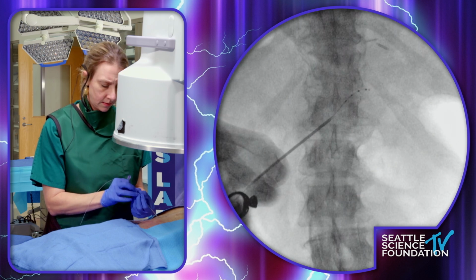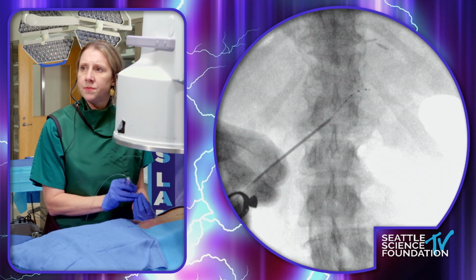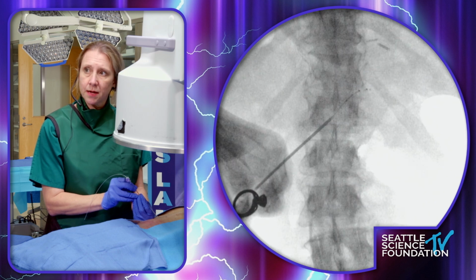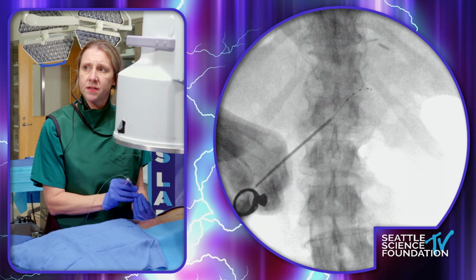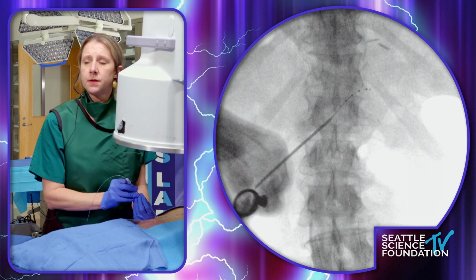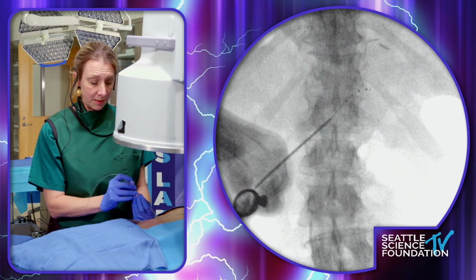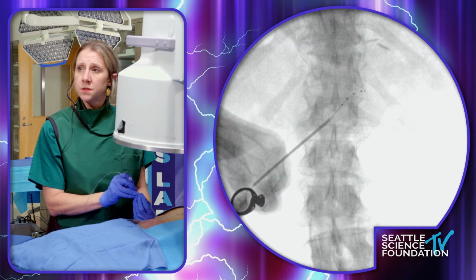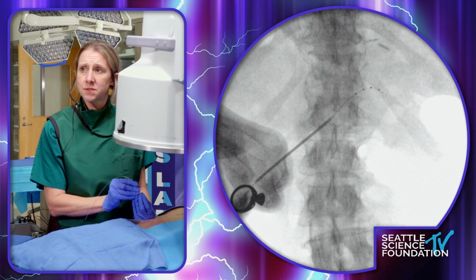Stop. Okay, so I can see that now it is beginning to extend out beneath the pedicle. And what you can see under live is, do you see how I'm jiggling this? What I'm feeling is tension. I'm feeling a soft, firm endpoint, which is caused by one of those many intraforaminal ligaments that I showed to you a moment ago. So I'm withdrawing it a little bit and just trying to take a slightly alternate route.